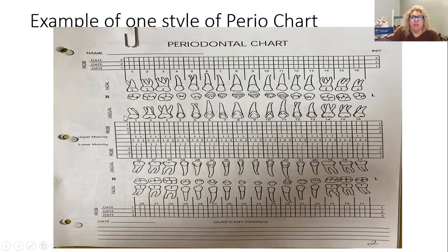Now when the hygienist or doctor stops probing, they might mark bleeding, they might mark recession, they might tell you other things that they want to notate for this maxillary arch. They might give the patient a chance to swallow. Also, as we're doing these probings, as we see the patient might need to swallow, catch their breath, the hygienist or doctor might take a break and we remove the probe from the patient's mouth and let them swallow. Well, they may have forgotten where they're at during that time. So every so often, the doctor, the hygienist will say, where am I at? Where do I need to pick up? And what they're asking is, what is the next number that they need?